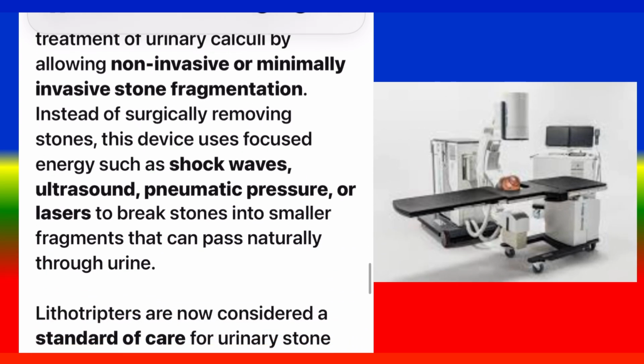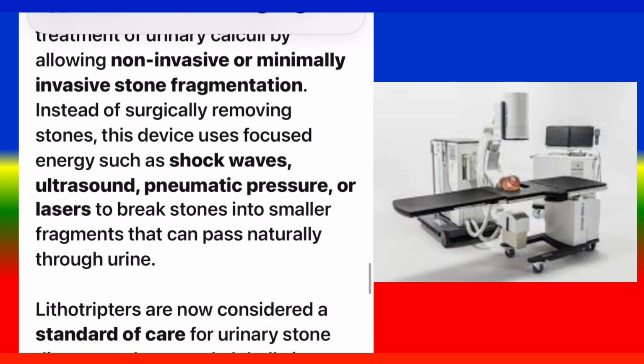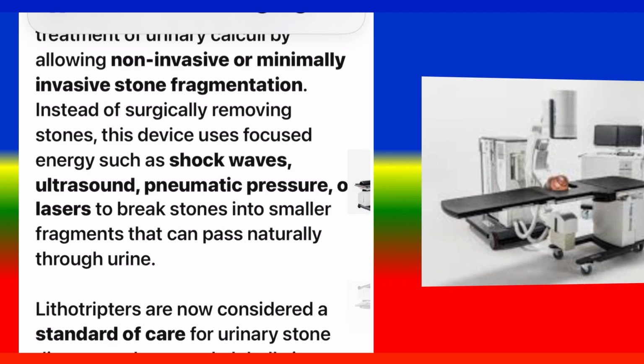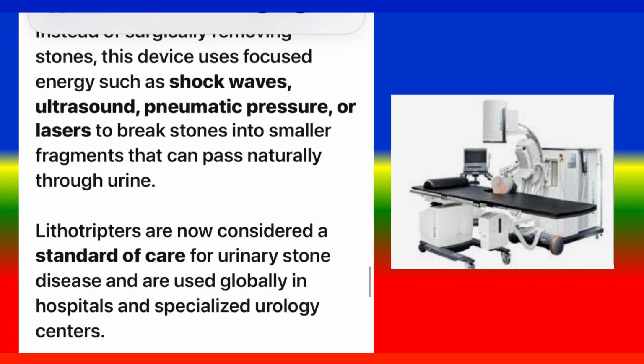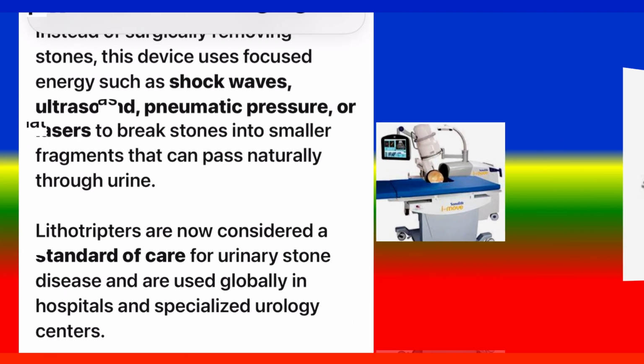Instead of surgically removing stones, this device uses focused energy such as shock waves, ultrasound, pneumatic pressure, or lasers to break stones into smaller fragments that can pass naturally through urine. Lithotripters are now considered a standard of care for urinary stone disease and are used globally in hospitals and specialized urology centers. Number 2. Definition.